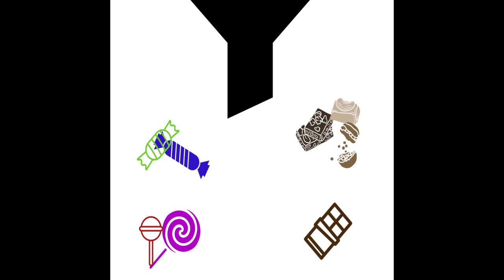So essentially, if the transducer sends back thousands of voltages that could be represented as thousands of different grays, the receiver isn't going to be able to do that. The receiver is going to want to take those thousands of voltages and parse them down into something that could be represented as hundreds of grays. It's still going to keep the very large signals large and the small signals small, but we're just going to reduce those options in between.